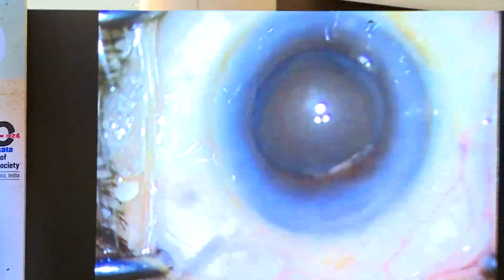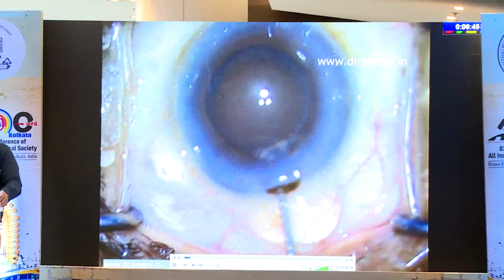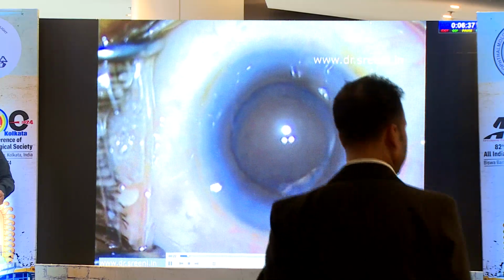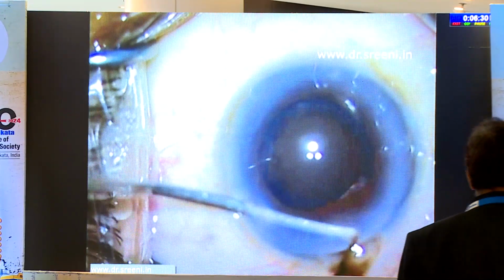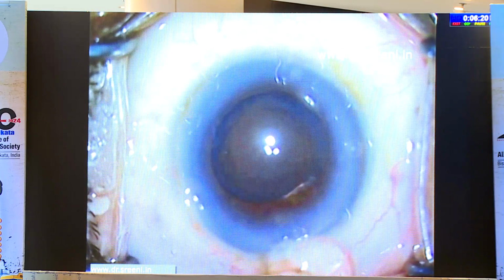This was a case of phacoemulsification, absolutely uneventful. There was nothing wrong till at the end of the phacoemulsification, the iris started coming out, the eyeball became hard, and the AC became extremely shallow. See, the iris is out, but I could somehow pull back the iris that had come out, but the eye was not taking in any more OVD. So there's no space in the anterior chamber, and the ball is hard.